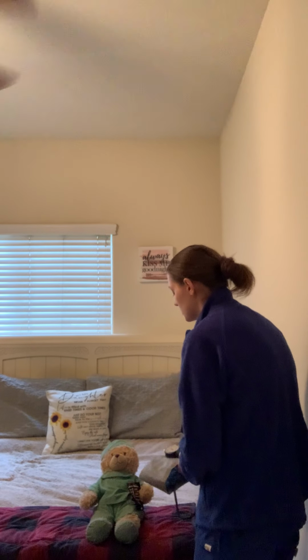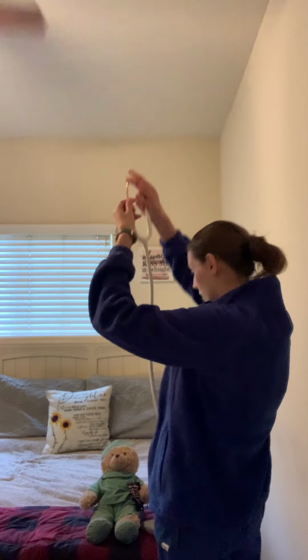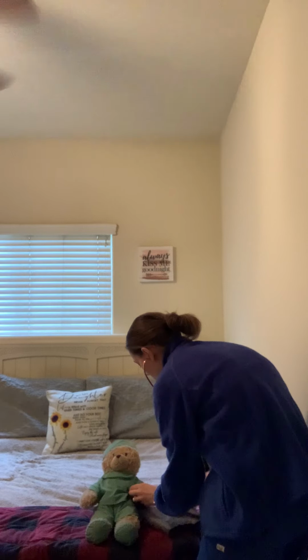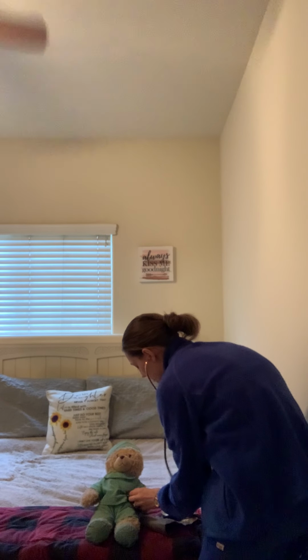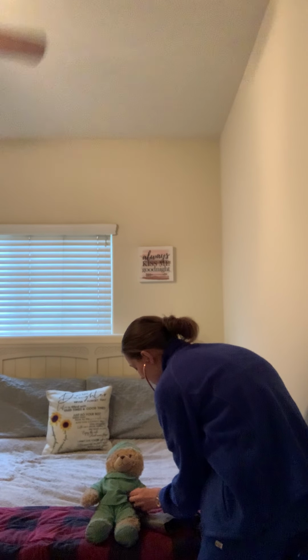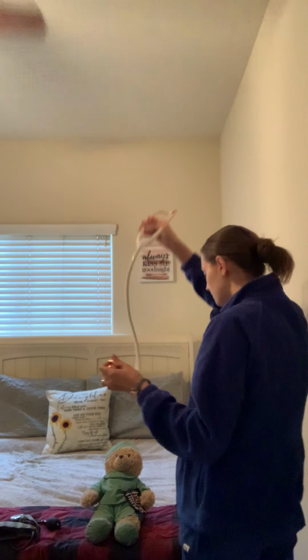So I'm just going to make sure this is around his arm, nice and snug, that I have the appropriate size for him. And then I'm also going to take my stethoscope and just listen at that artery. And I can ask him, what are your normal blood pressure findings? He's told me 120/80, so I'm going to go ahead and turn the dial to the right, pump it up to about 150. And as soon as I hear that first sound, that's going to be my systolic. Continue to keep releasing, and that last sound will be my diastolic. So I did get 120/80.